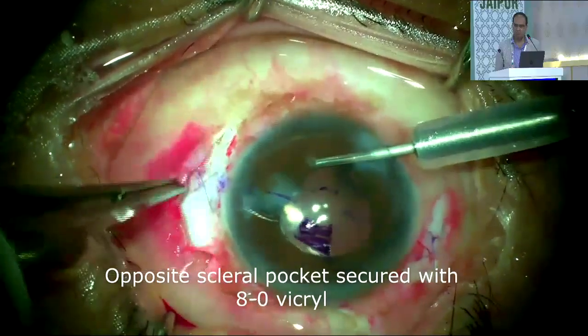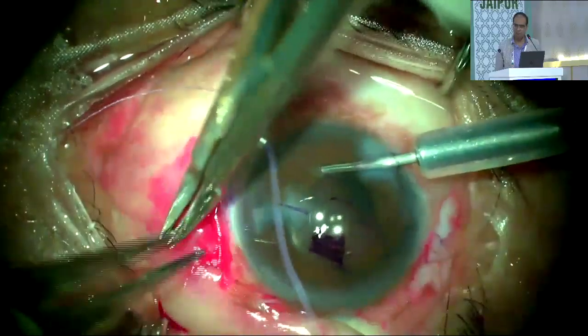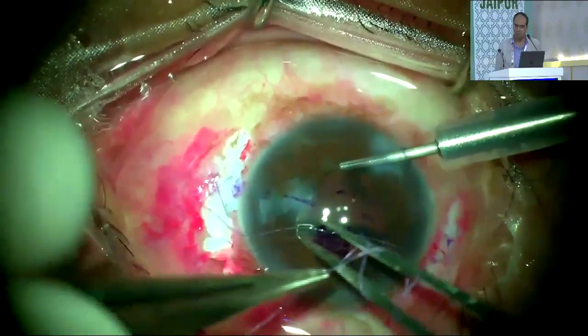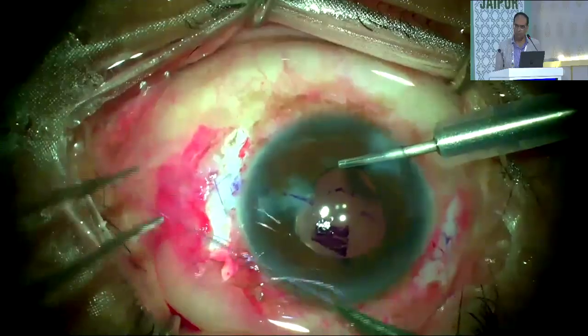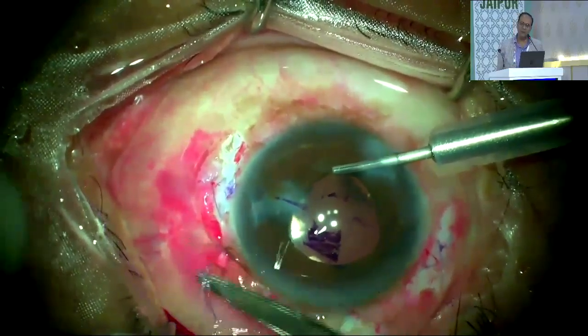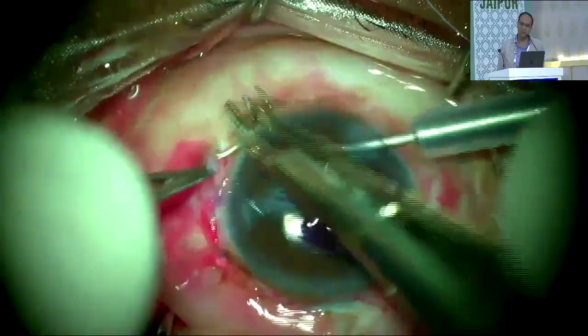Then the conjunctival flaps are also sutured. You can also cauterize these flaps if you want, or place glue if required.